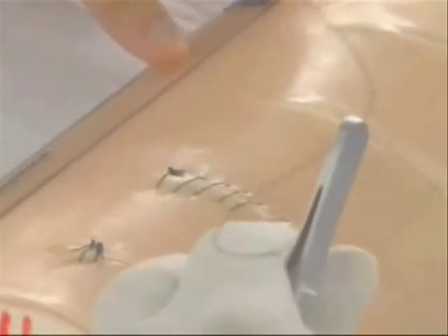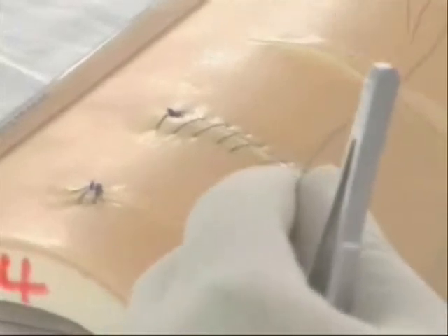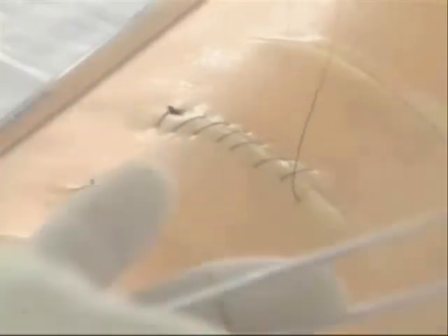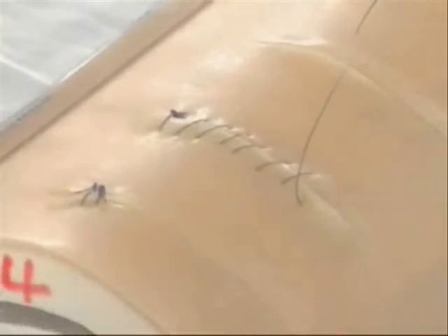You can go on and on. So if I want, I will now tie a knot — and that is a continuous suture.